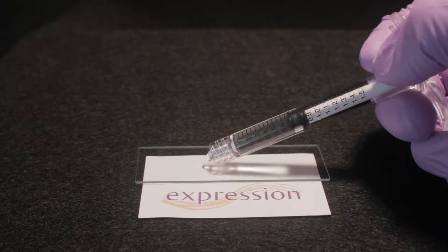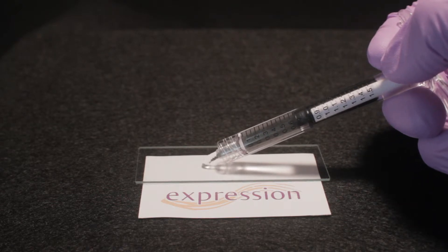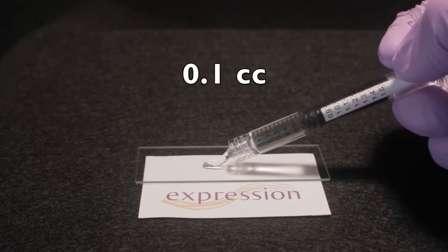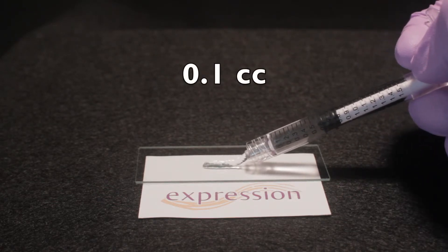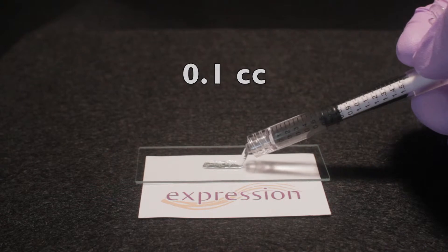I will begin by placing 0.1 cc of the expression hyaluronic acid, or HA, onto the glass slide.